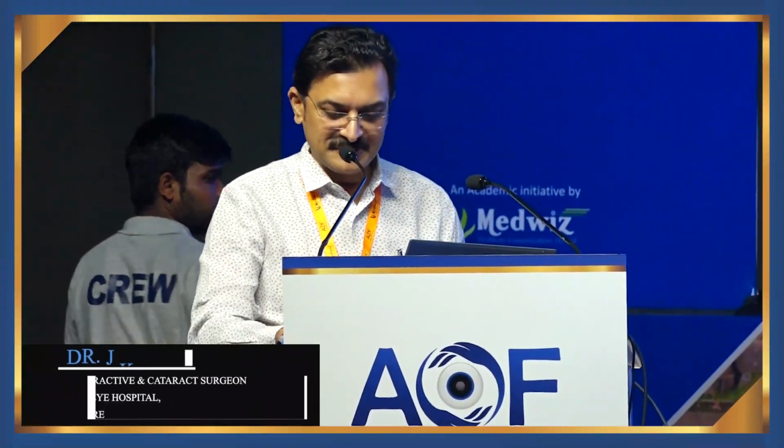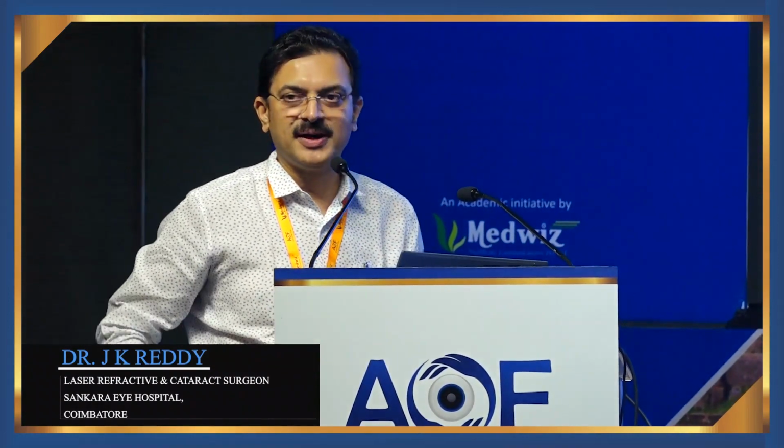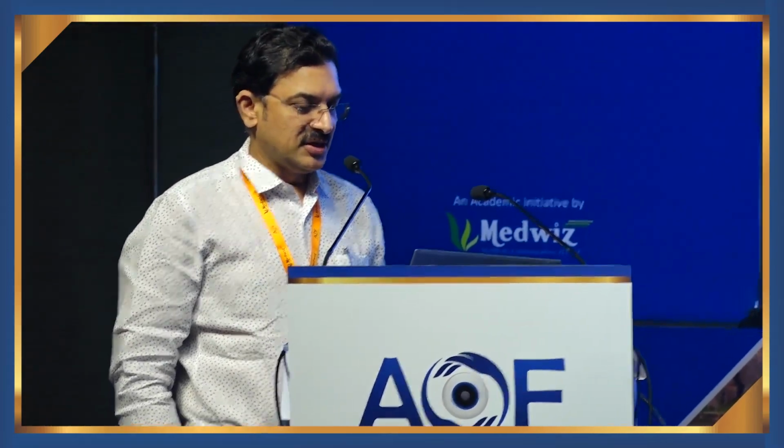Good evening. In the allogenic implant, the difference is that we are implanting extra tissue, versus a transplant where we replace. So this is a much easier way than transplant. Coming to keratoconus and ectasias, we tried an implant size of 7 to 8 millimeters, 200 to 300 microns, and a depth of 150 to 200 microns.